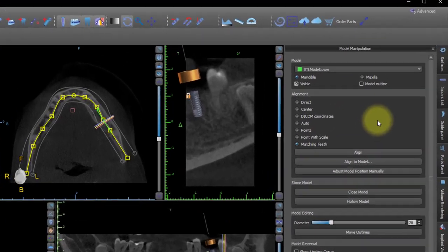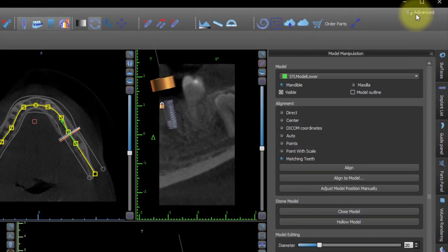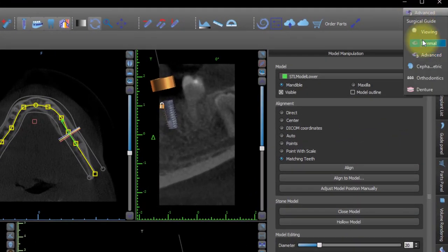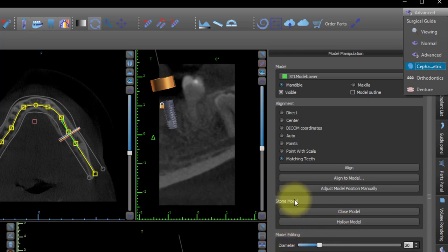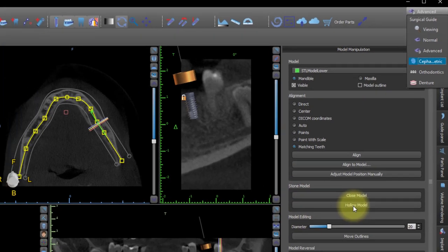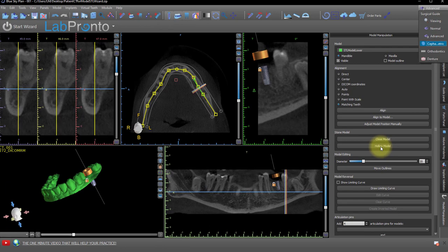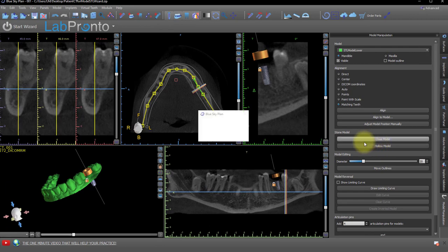Regardless of if you are in Advanced or Normal mode, you will still have the same items under the Stone Model setting: Closed Model and Hollow Model. If your model has been imported and it's open, click Closed Model to create a closed model.